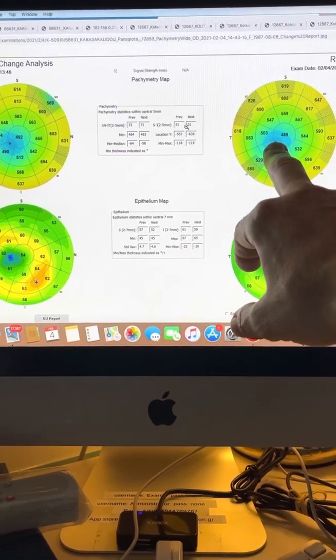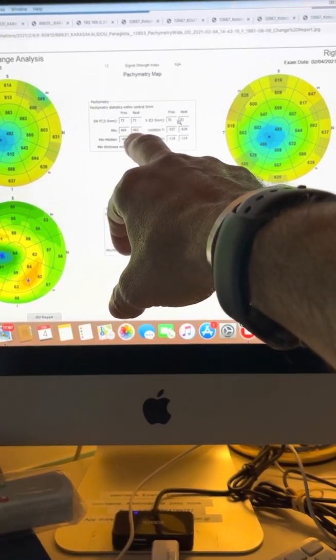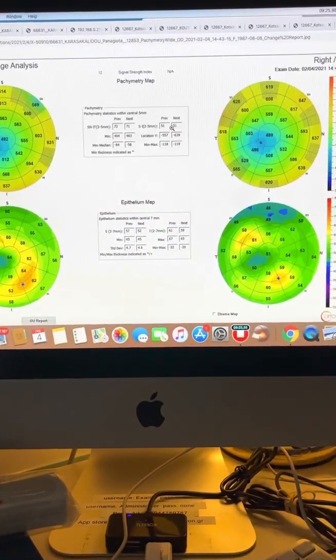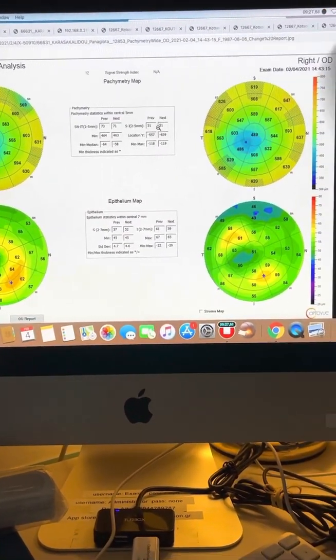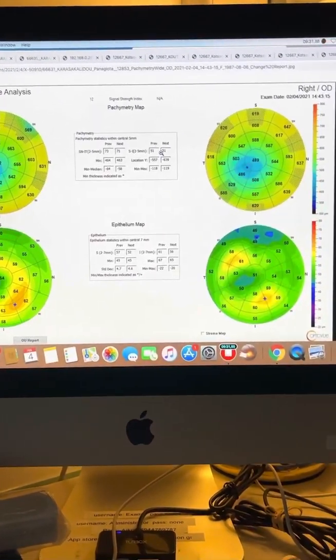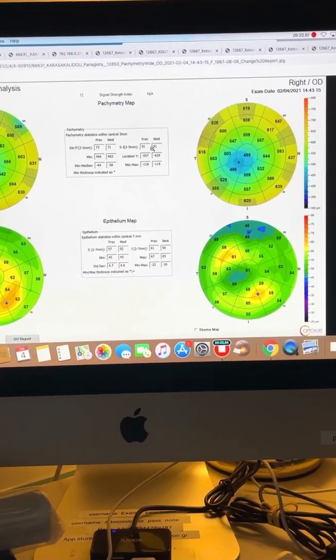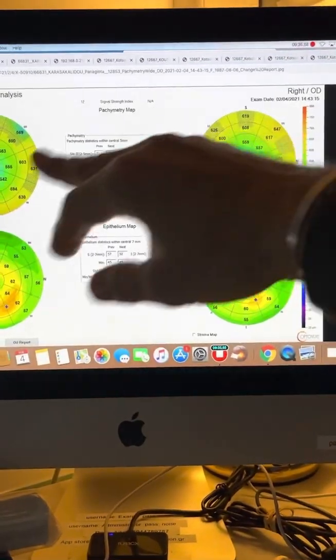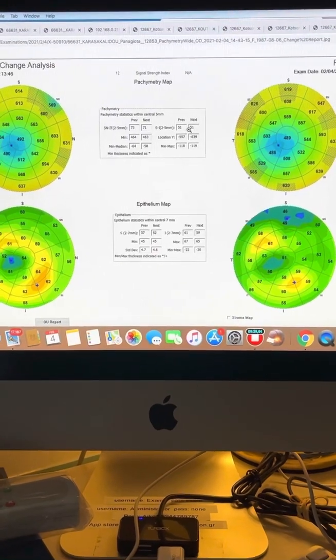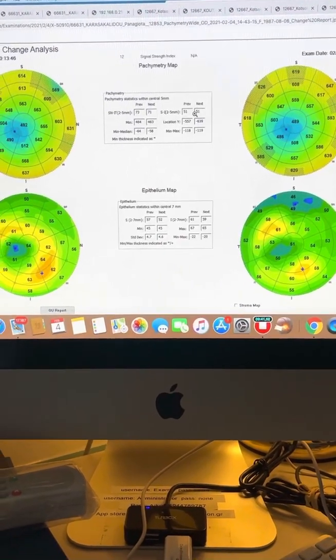While the minimum corneal thickness has remained the same, 463. So this tells us that although the Pentacam maps look worse, probably because we have this shift in epithelium, there's no progression of the keratoconus. The actual corneal thickness is the same. The overall corneal thickness pattern is the same. Her vision is the same. She's not rubbing her eyes. And this is very reassuring.